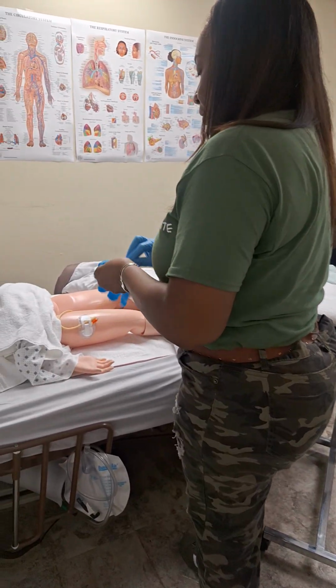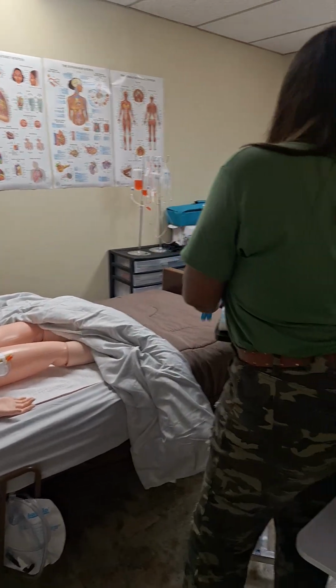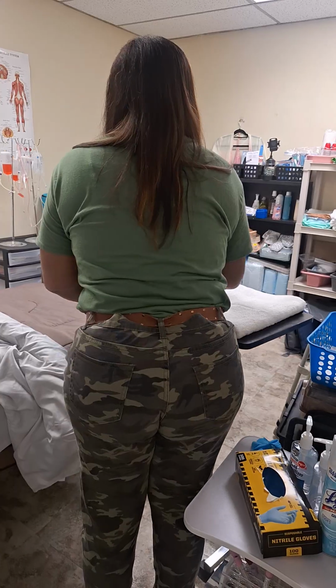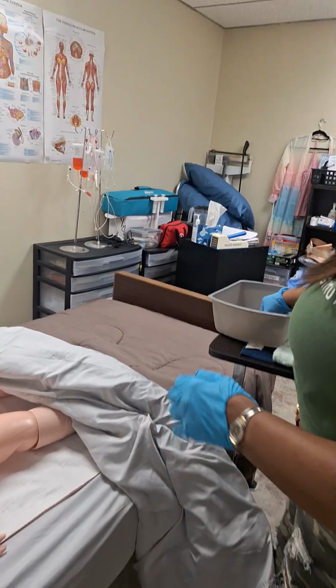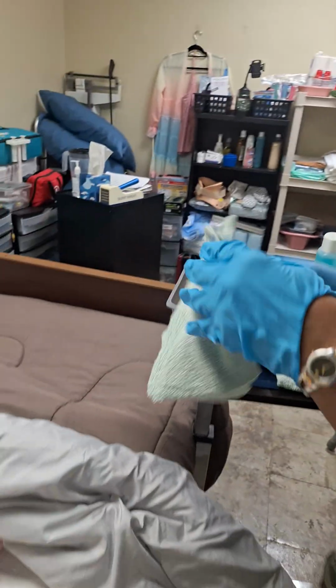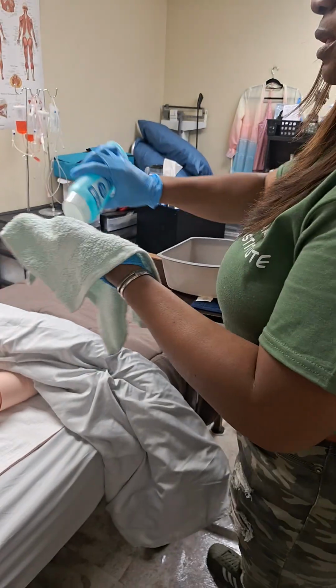Now that I have my gloves, I probably should turn this around, like so. Now I'm going to take my towel, submerge it in the water, squeezing out any excess water. Then I'm going to open up my towel and apply my soap all around so I get it all up on there.